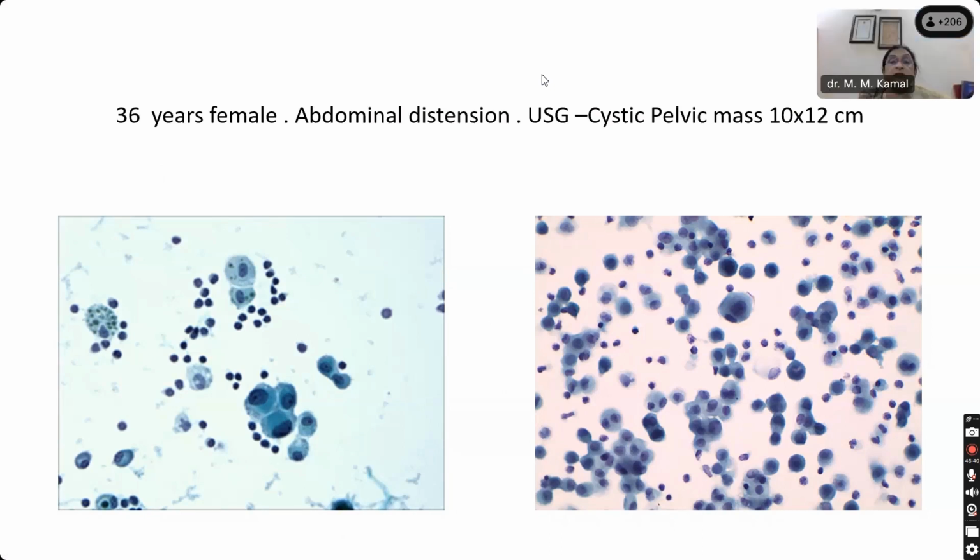So this is an ascitic fluid that has been sent to the laboratory. What are you seeing in the smears? Ma'am, in the smears, I can see the mesothelial cells showing the windowing effect. Some reactive mesothelial cells can also be seen with binucleation, and the background shows proteinaceous material. Some lymphocytes can be seen. These are the macrophages with engulfed material, and these are the mesothelial cells.